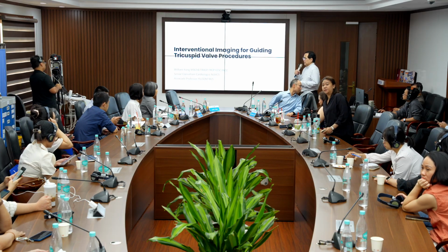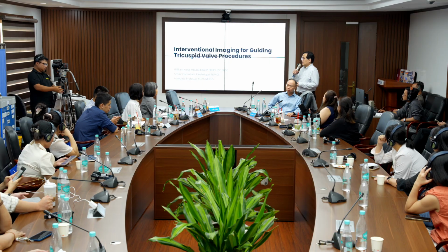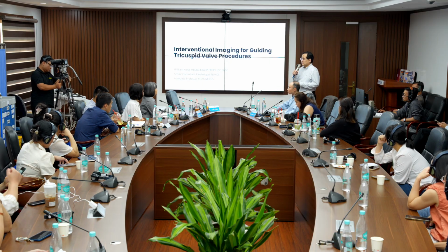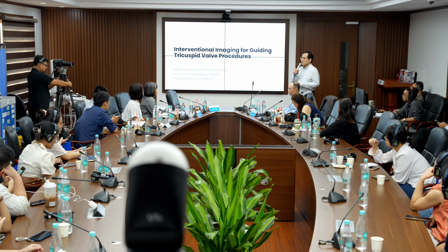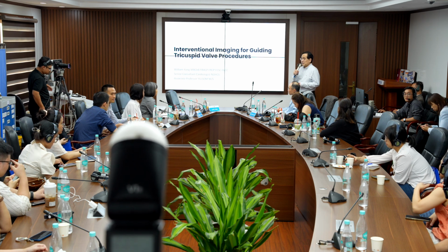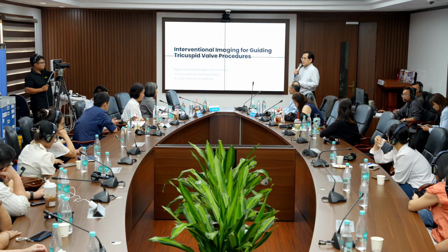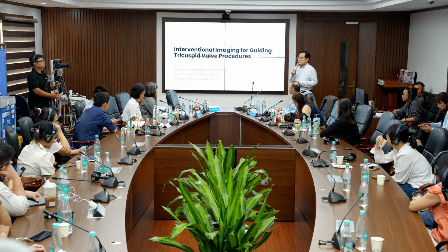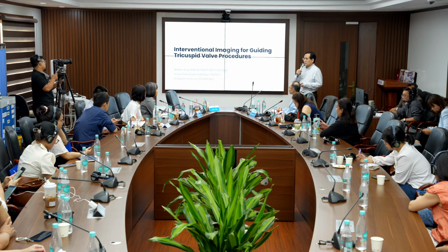As you know, the TRILLUMINATE study was published like 2 years ago for the TriClip outcome. Unfortunately, it does not improve survival. It only reduces hospitalization, improve patient NYHA status. But nevertheless, there's still some group of patients that will benefit from TriClip, especially those with severe right heart failure and right ventricular overload.